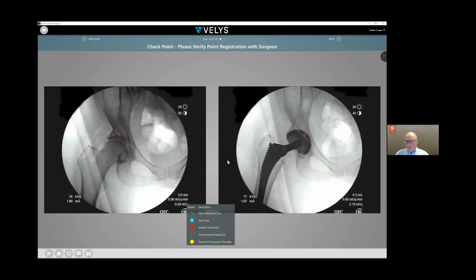When I started doing hips in 2011, I was kind of self-taught, and did not have any education of it in fellowship in 08. I got really good at the approach, but had a lot of problems with what I call the inefficiencies of anterior hips. People that do a lot of them understand what that is: use of fluoroscopy, trialing, retrialing, re-x-ray, redrawing lines. And that was where we were at in 2011.